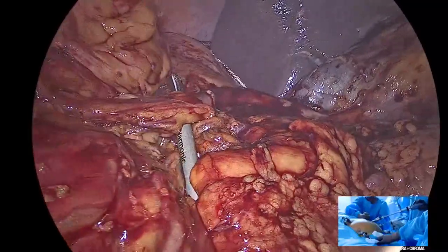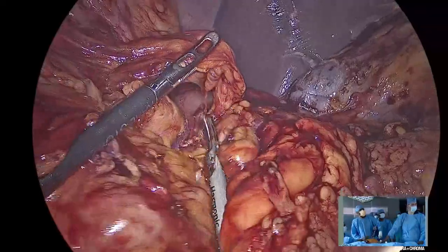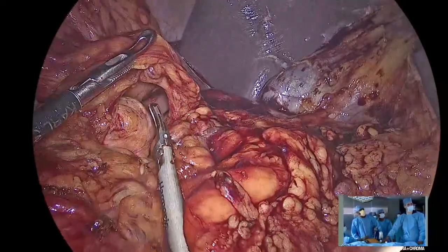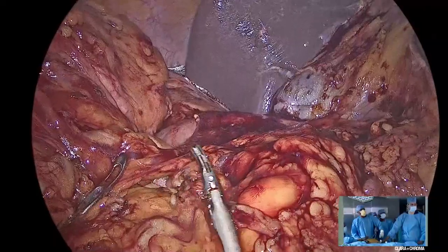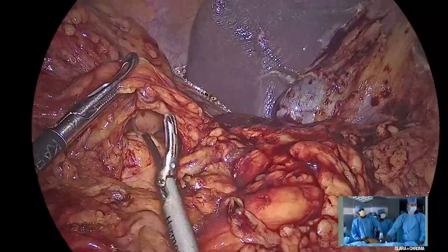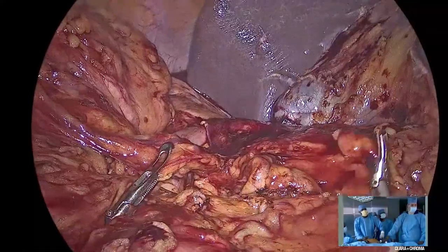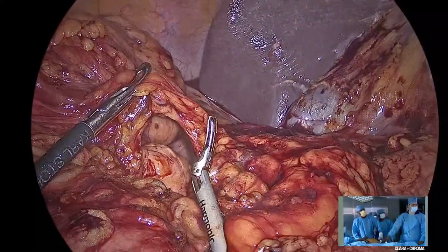Can I just say something here? Okay. I think, Anil, I have a feeling this has the right gastrocolic trunk, the colonic branch of the gastrocolic trunk of Henle, which starts there, has given the epiploic branch that way, and the colonic branch is coming this way. Whatever it is, I'm going to clip it.